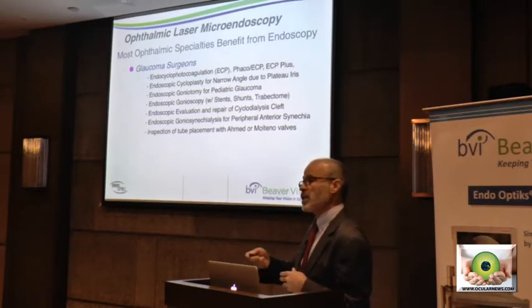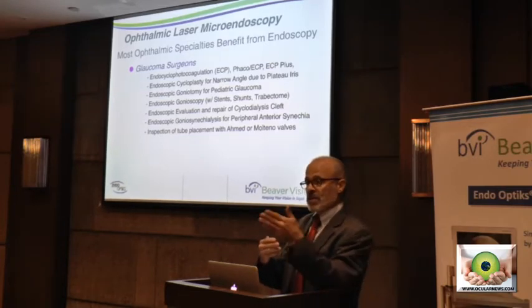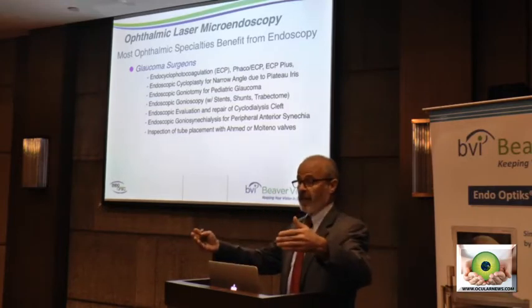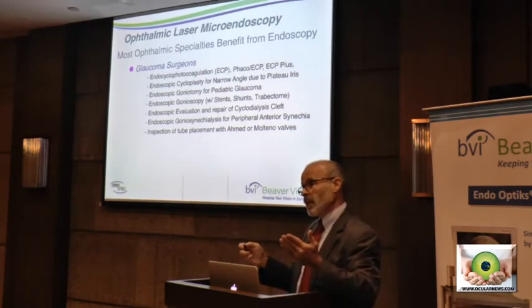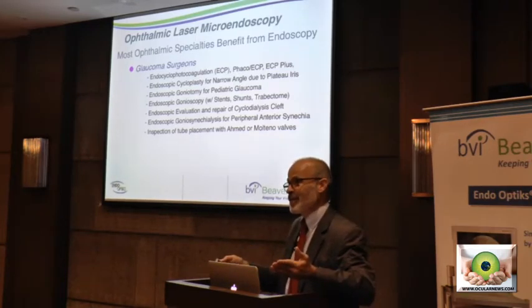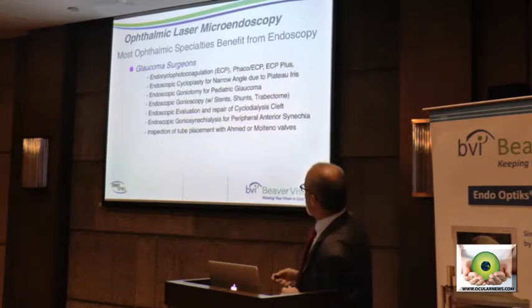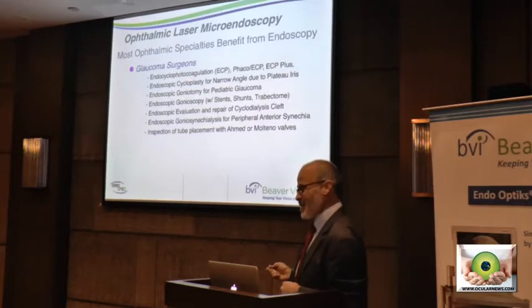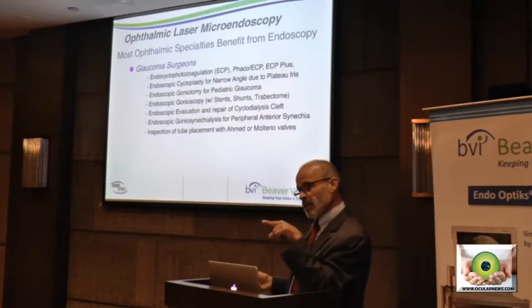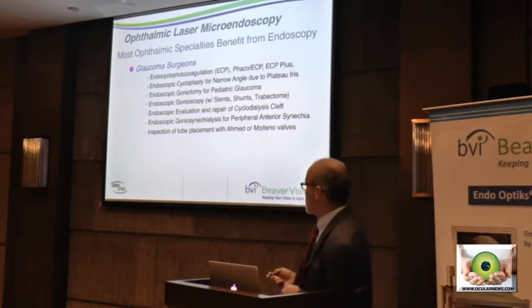They do a light ECP treatment combining the two with a mechanism similar to using a prostaglandin and a CAI, for example, you know, you're modulating both inflow and outflow. So we've been doing it medically for years and years. Surgeons are beginning to consider doing it surgically. And then treating PAS, goniosynechialysis, with the endoscope. Again, people use the endoscope both for visualization and in lieu of a spatula, so a one-handed technique through a paracentesis.